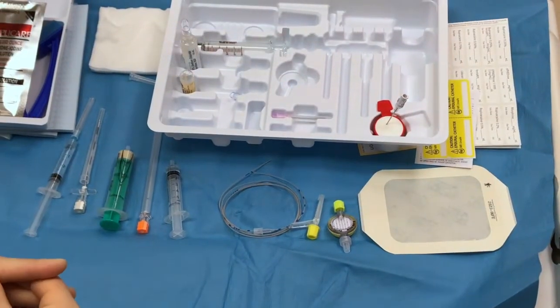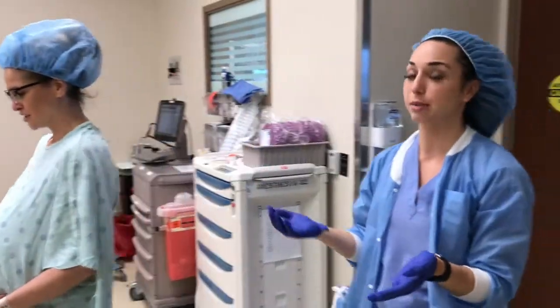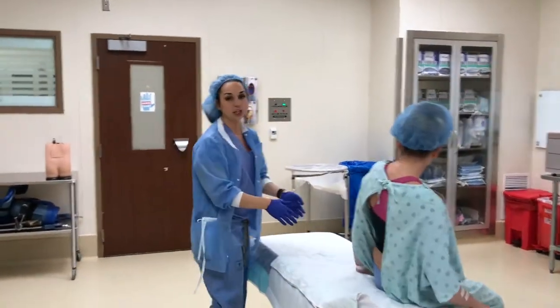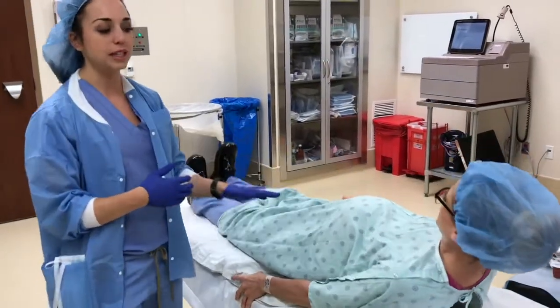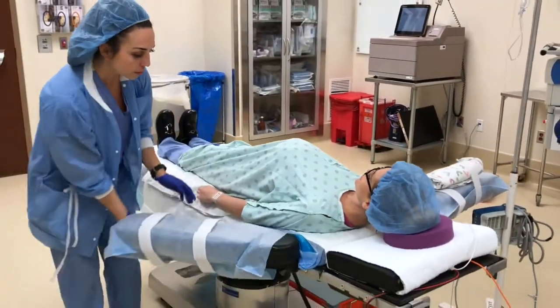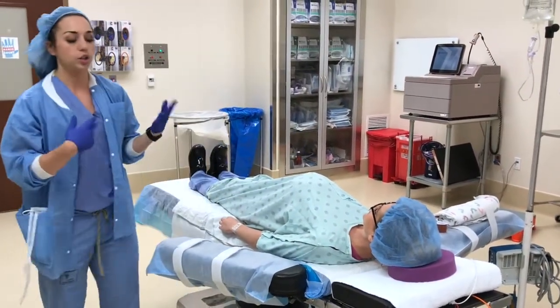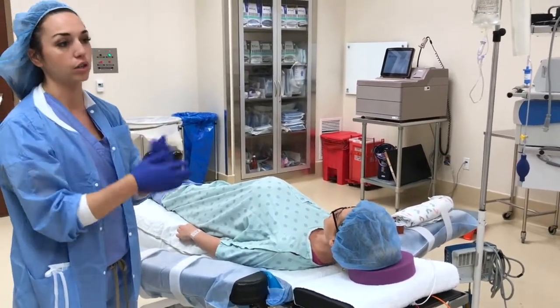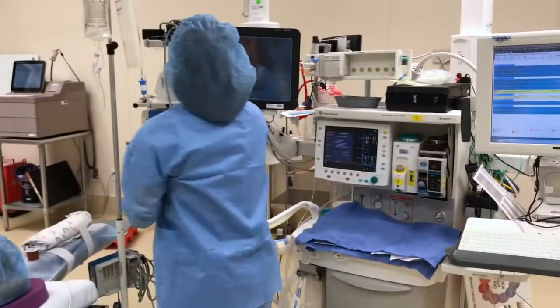Again, unlike many other surgeries, we actually have our parturients, usually, especially the scheduled C-sections, walk in or waddle in as they may. The patient comes over to the side of the bed. Usually your nursing staff will help position the patient properly. At Parkland, we do begin with a 5-minute fetal heart monitoring. So we'll have the patient lay down, and the nurses will help put on the fetal heart monitors on mom, while you would obviously start your anesthetic record, get into the Pyxis, get your basic drugs and the things that you need out, and then start applying your monitors. So we'll begin to do that now.